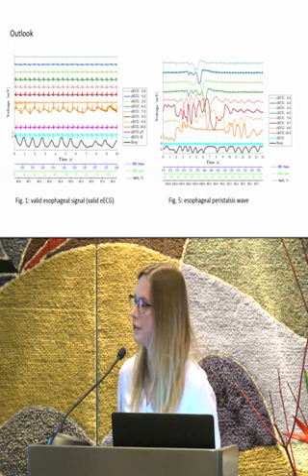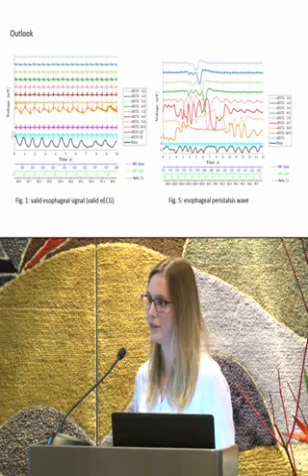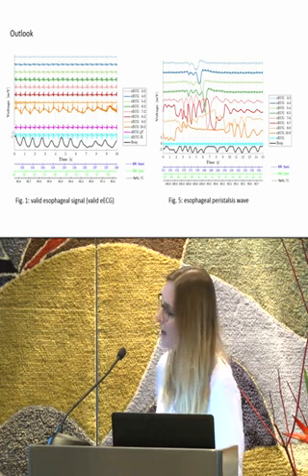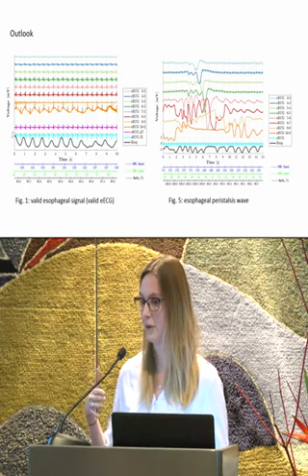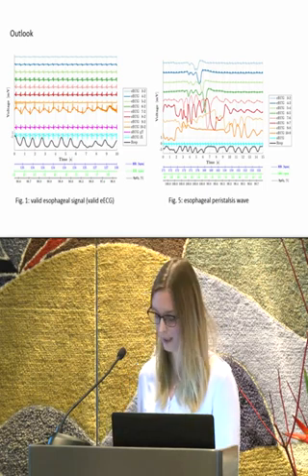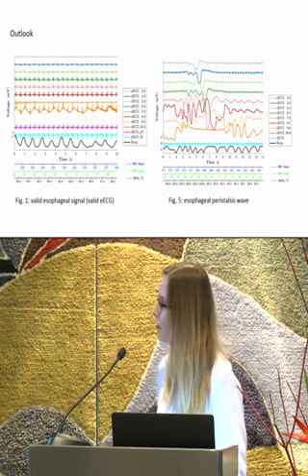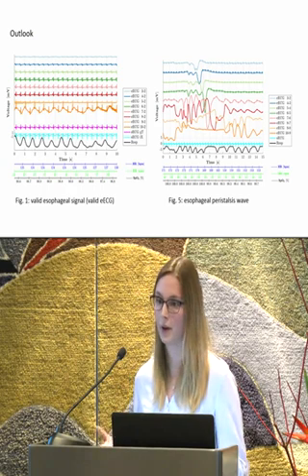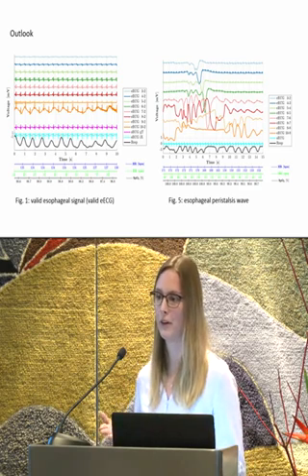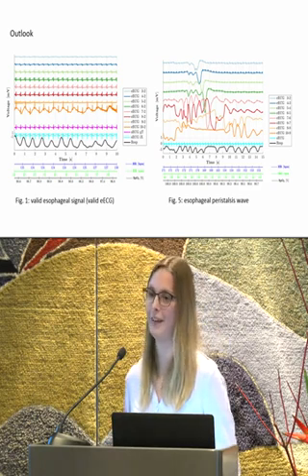Looking further into the future, we are now trying to do the same extraction with the respiratory rate. As you see on this slide, we have a nice respiratory signal in the more distal part of the electrodes. We were also able to extract swallowing acts. Here you see a peristalsis wave going through the esophagus, starting proximal and going more distal. So we are able to visualize a swallowing act. If we imagine that we could continuously monitor swallowing-breathing coordination, this kind of monitoring is really interesting.